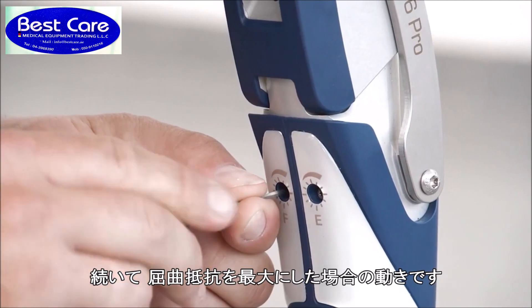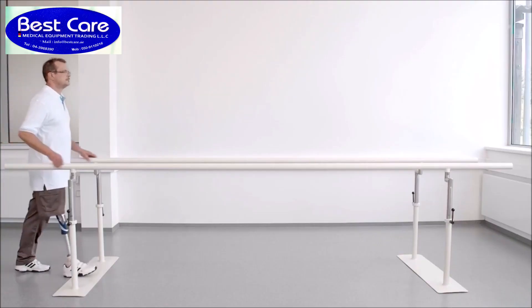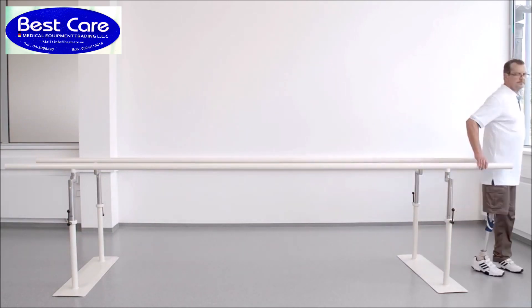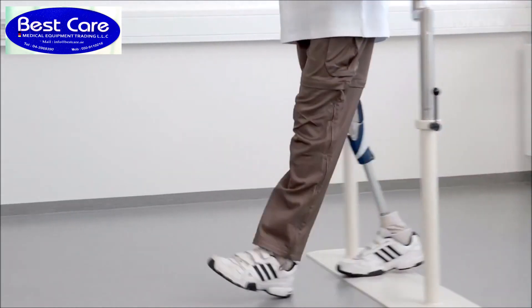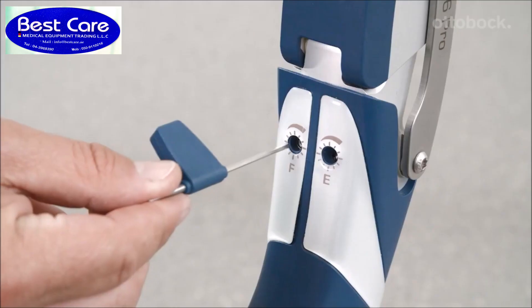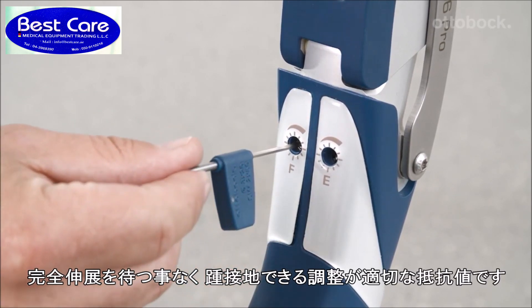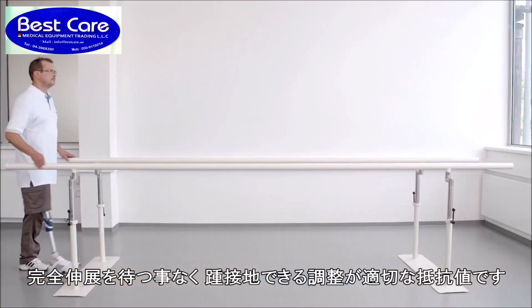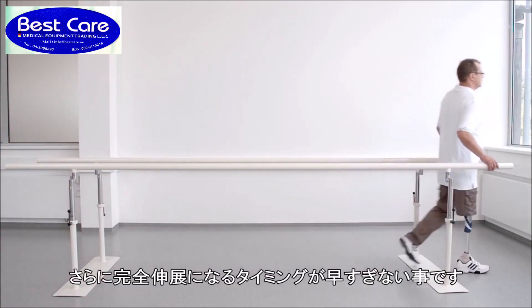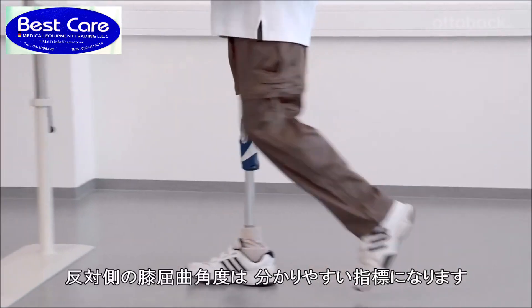At this point the flexion damping is shown at its maximum. The optimal setting of the damping is reached when the user doesn't have to wait for the prosthesis to reach full extension at heel strike, and the prosthesis doesn't reach its full extension too early. The knee flexion angle of the contralateral side provides a good orientation.